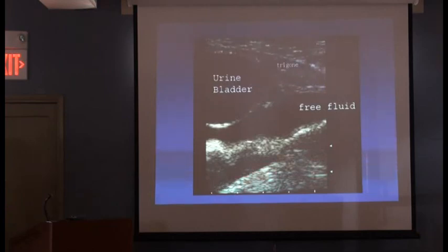All right. This is the bladder. Now, this is why we say the bladder has to be filled. Sometimes if it's an old lady that falls down, I don't bother, because she's not going to have intra-abdominal fluid. But this is why the radiologists really harp on us to do this. Only with the bladder filled can you really see the free fluid here. And that's free fluid. All right, so there is a method to the madness for having a bladder fill.